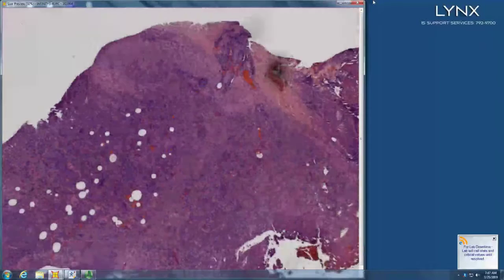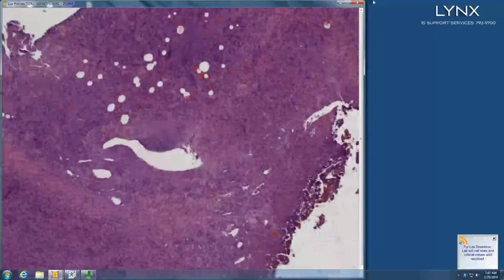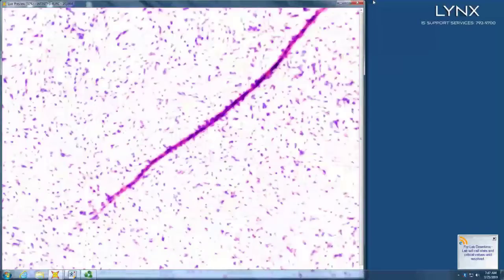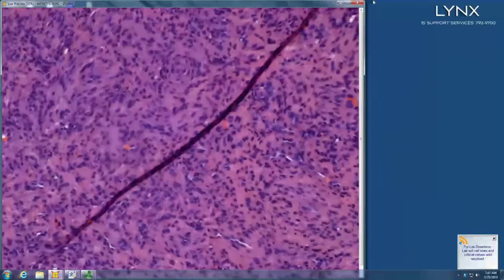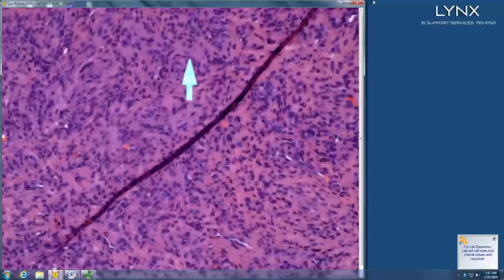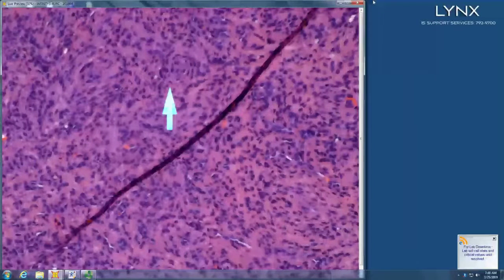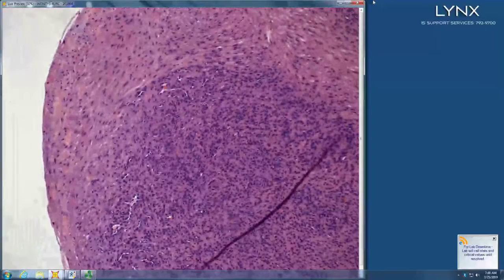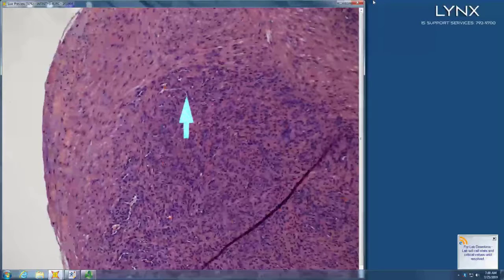Skin deeper. Yeah, so like a soft tissue neoplasm again. Like a little spindled. And you got these rosettes of round cells around something, and the something they're around is vascular.